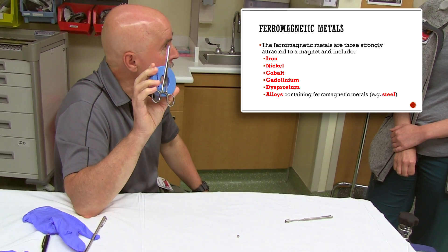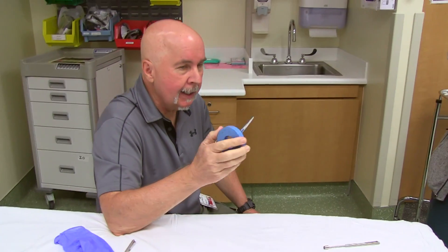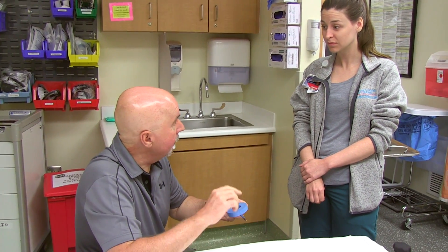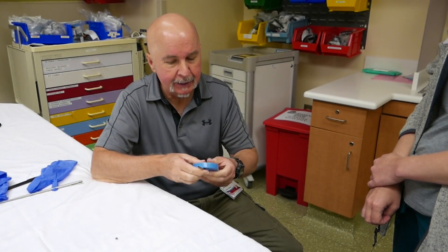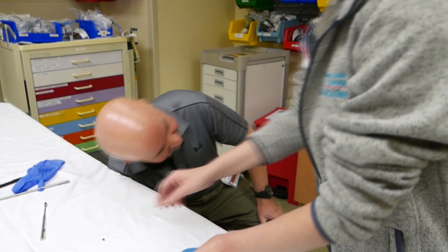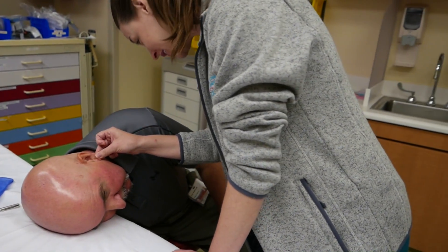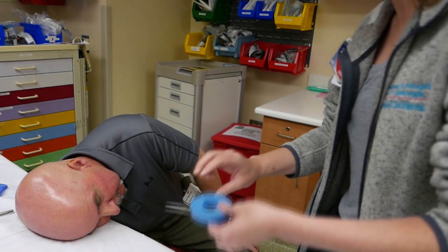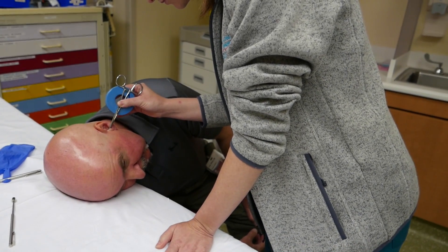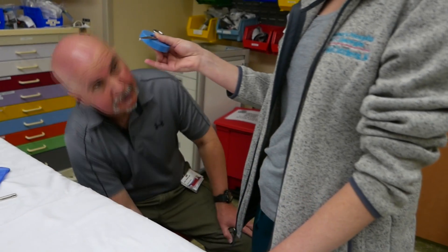This time I'm going to go ahead and use the pacer magnet. This doesn't have as much force — you have to be a little more gentle in pulling it out because the magnetism is not as strong. Let's go ahead and do it again. And you can use a screwdriver — anything that is fairly narrow. I heard it jump out. It worked great.